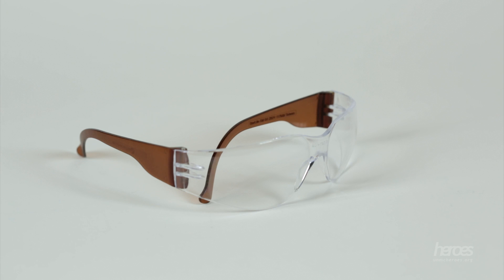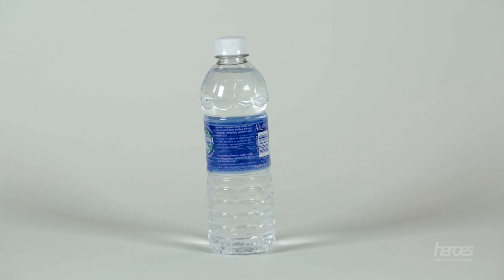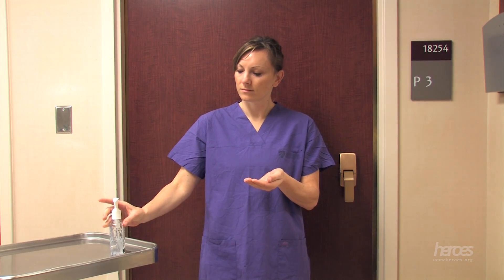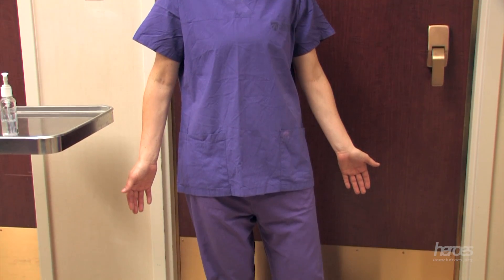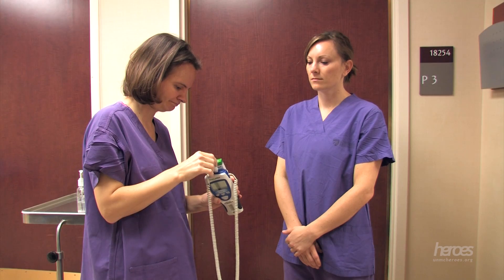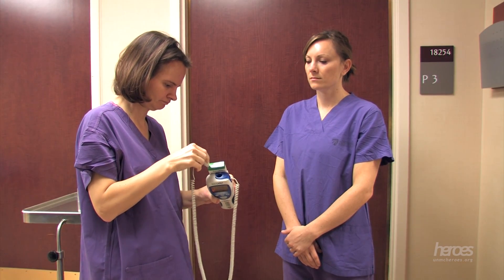Optionally, you can use protective eyewear if desired. At least 8 fluid ounces of a non-caffeinated beverage and hand sanitizing gel are also needed. A donning partner should assure that all donning steps are completed properly by assisting with securing ties, taping, or strap placement if necessary. The donning process should start with the healthcare professional performing hand hygiene. Next, they should change into scrubs and washable footwear. All jewelry should be removed — this includes rings, watches, necklaces, and earrings. The donning partner should now take and record the healthcare professional's temperature.